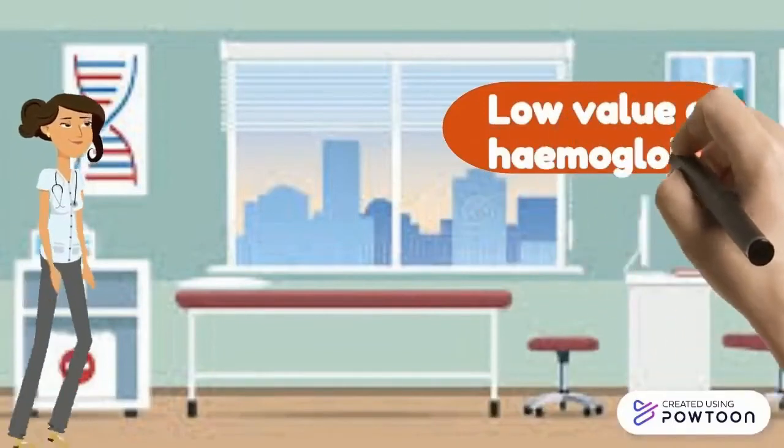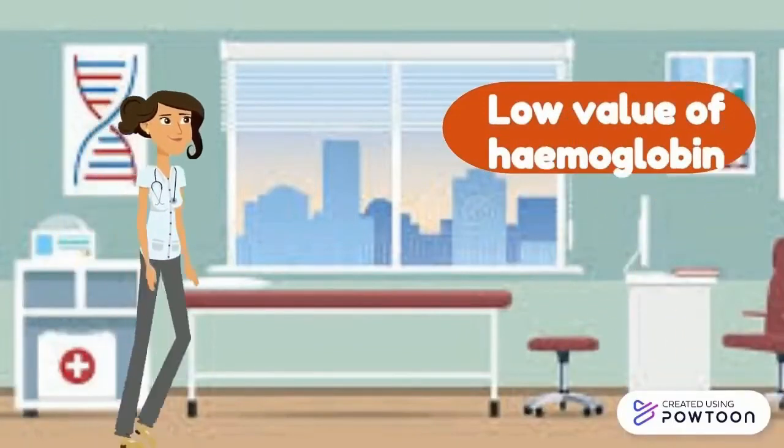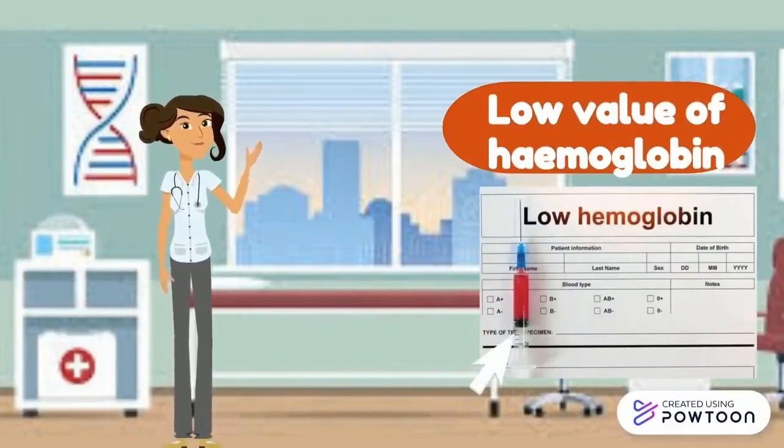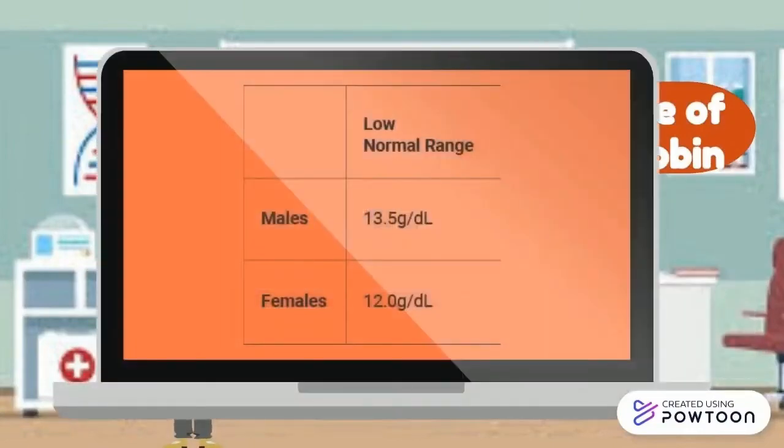We could indicate the range of low level of hemoglobin by using this reference. For male, the range is less than 13.5 grams of hemoglobin per deciliter, and for female is less than 12 grams of hemoglobin per deciliter.